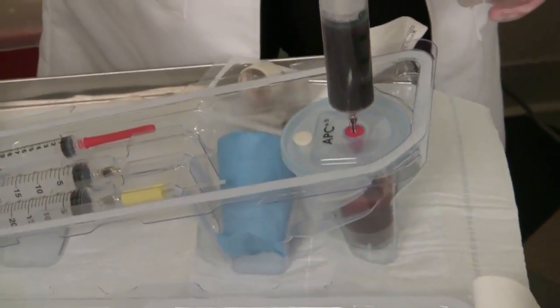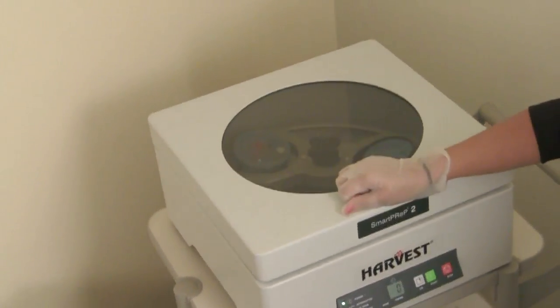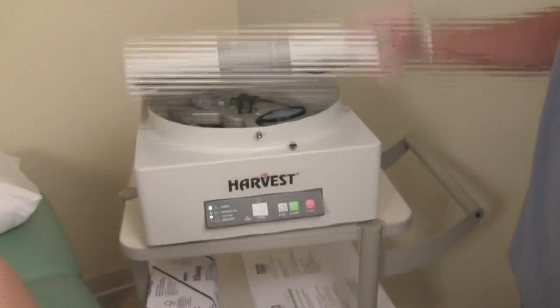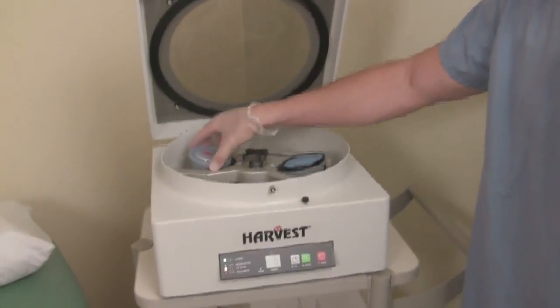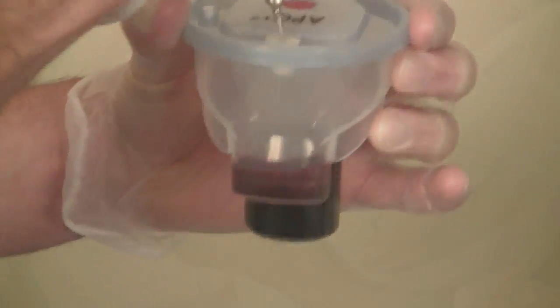Here the blood is placed into the PRP kit and it is going to be centrifuged. The platelets will be spun down. The platelet-poor solution is removed and a small portion of it is mixed with the platelets to create a platelet-rich plasma solution.